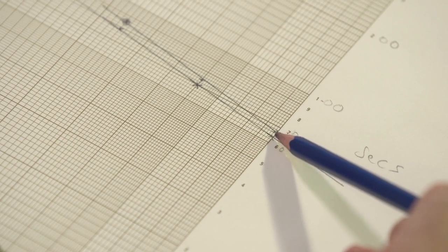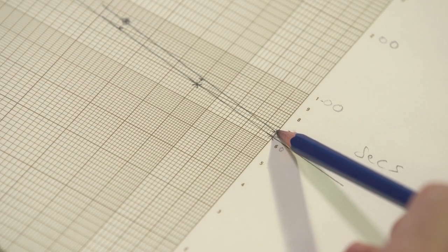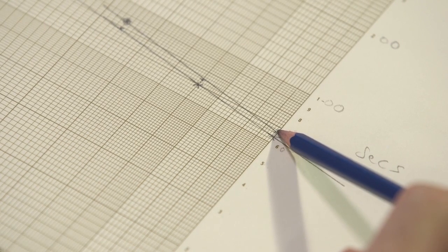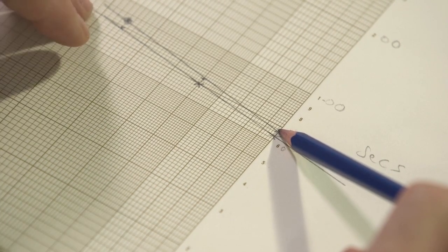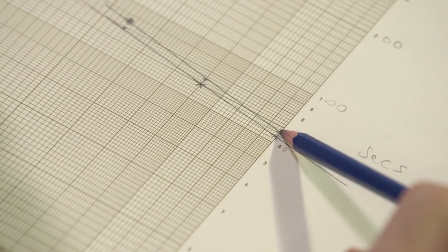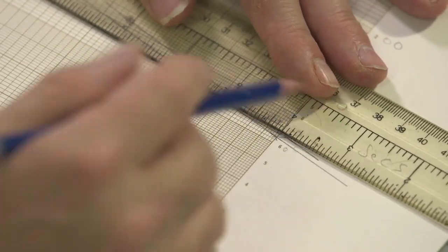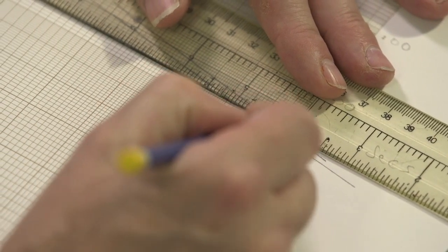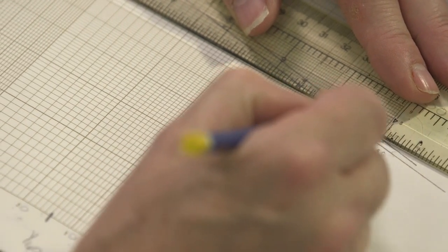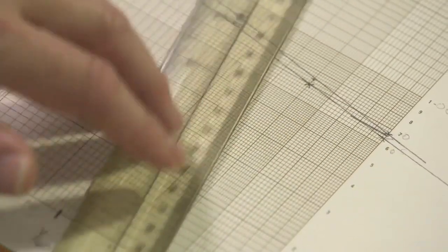And in this case, around that 67 seconds. And then we ask a question, which is the concentration of the standard which would have clotted in 67 seconds? And the simple way to ask that question is to take a horizontal line from this point where it cuts 100% and look where that clotting time occurs on the calibration line, and that's here.